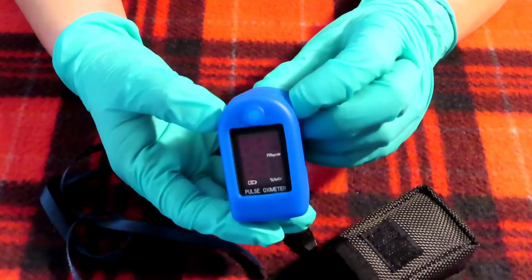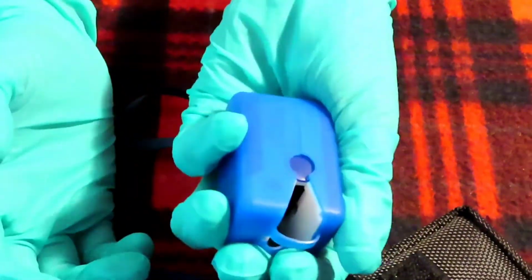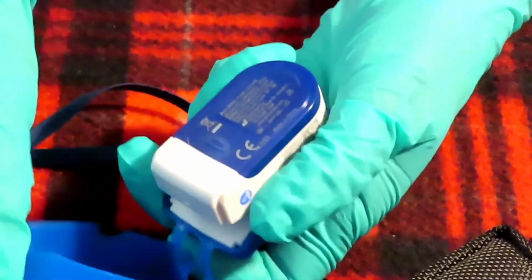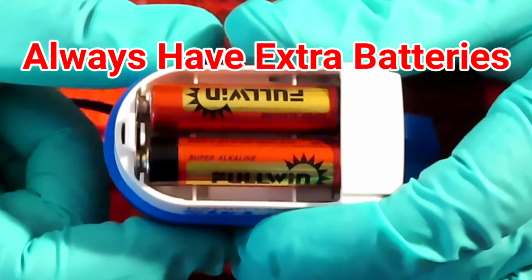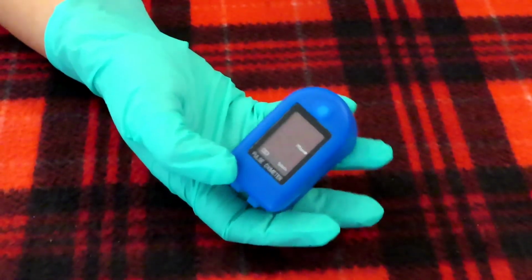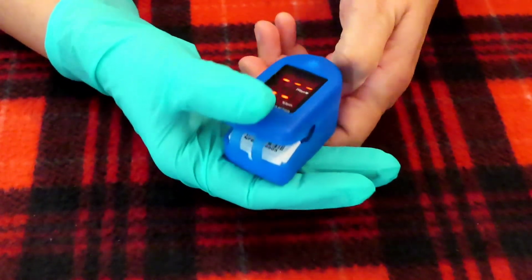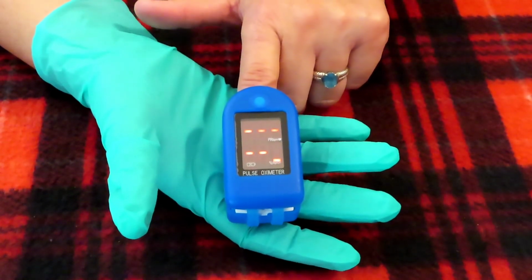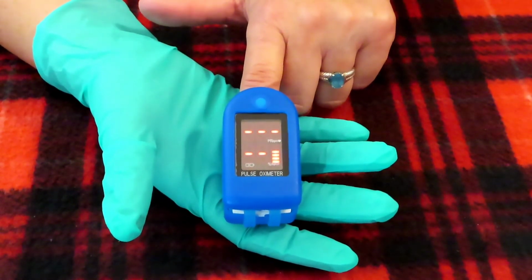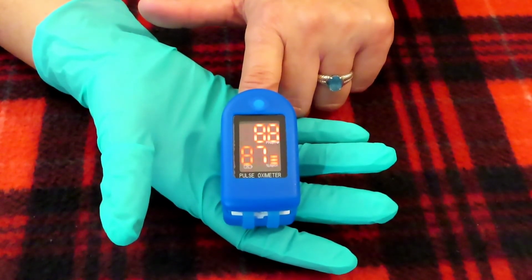There are different styles, manufacturers, sizes, and features. This one is really convenient and could be held by the palm of your hand. It does have two AAA batteries, so always have extra batteries in stock. This one is very economical and easy to use. You simply turn on the start button here, and you press the clamps together, and you place your finger inside. You're going to wait about 5 to 10 seconds for it to capture the pulse rate and the oxygen saturation. You'll see a display and it's still doing some adjustments.